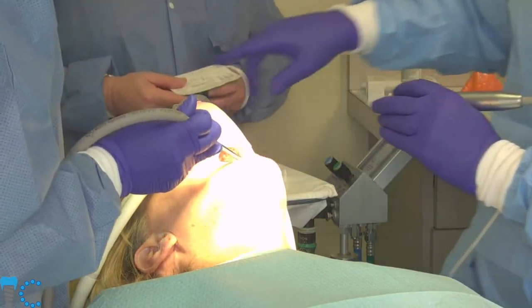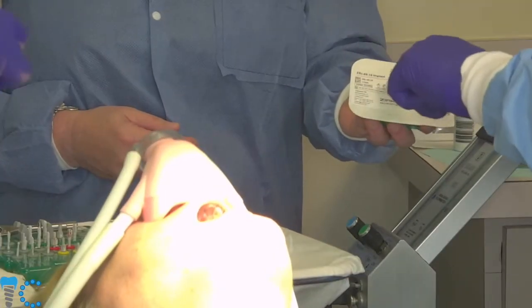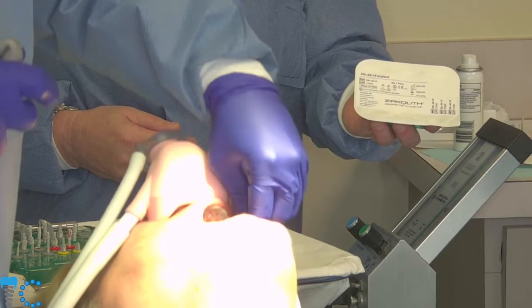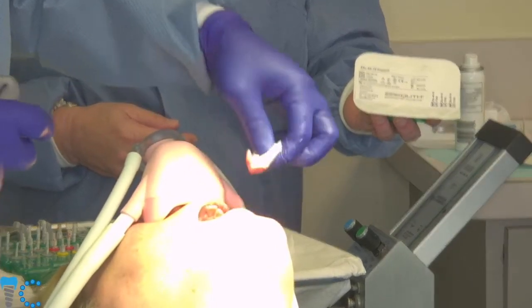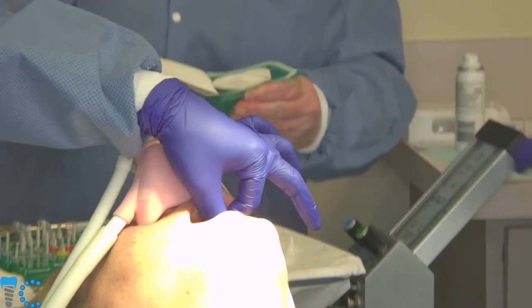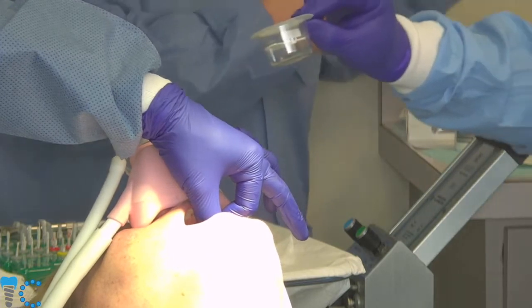So at this point, can we see Marie over here? Yes. So she has our implant. We can confirm it's a 4x10. It says Z5C-40-10. So we have a Z5C. 40 stands for 4 millimeter diameter. 10 is the length. So she's going to peel open this peel pack, and she's either going to dump this container on our tray or I'm going to pick it out because this is sterile. The outside of that pack is not.